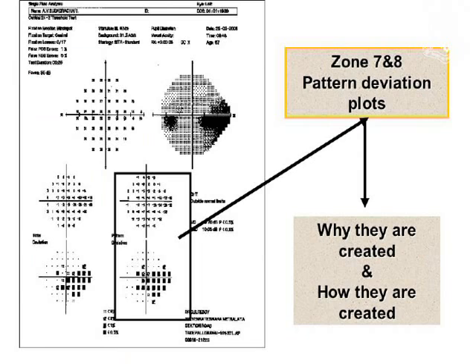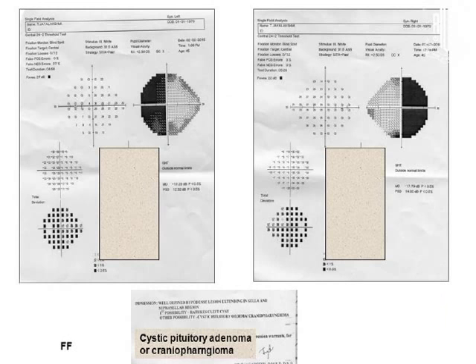So the scotomas can be localized scotomas or generalized scotoma. When there is a localized scotoma, the pattern and the extent of the field defect can be known in the total deviation probability plot. The total deviation probability plot and the pattern deviation probability plot look similar. The total deviation probability plot is showing generalized depression.